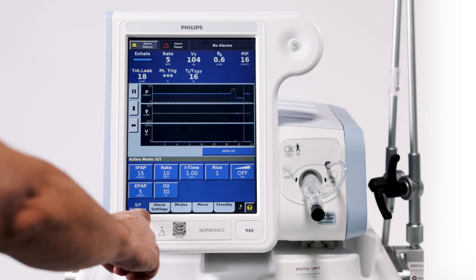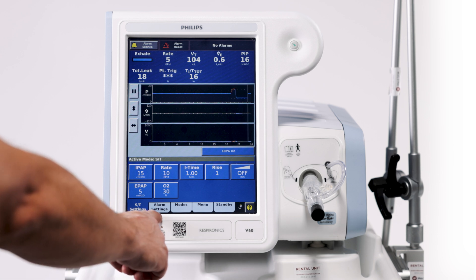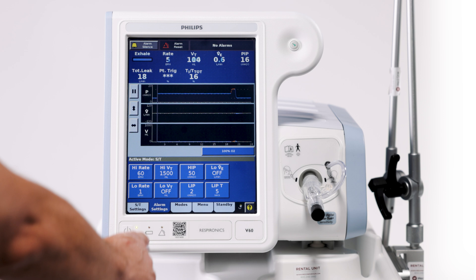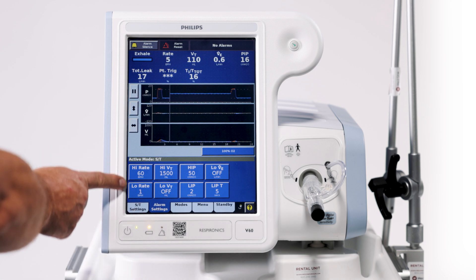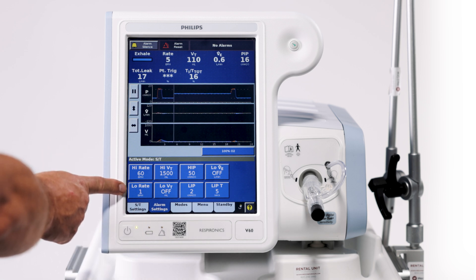Down here in this parameter is our alarm window. These are all the patient alarms in here.